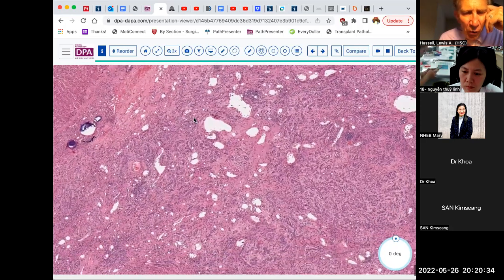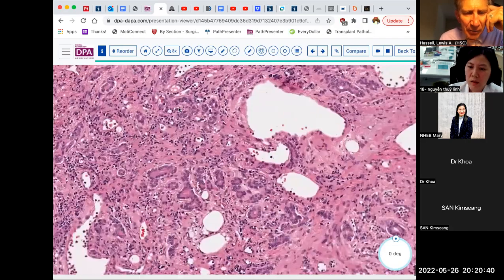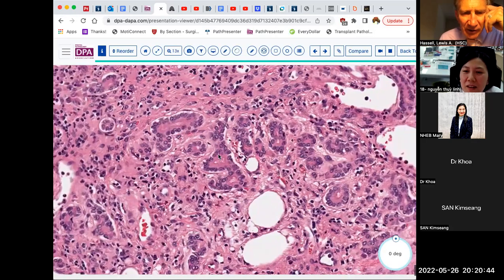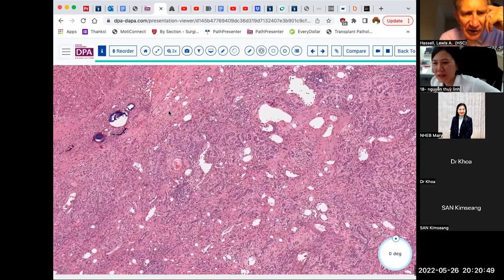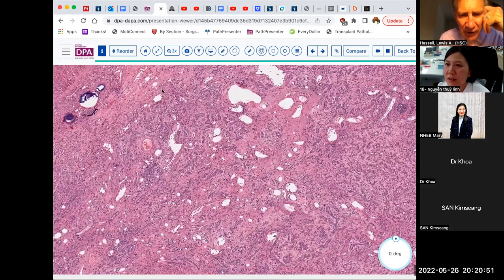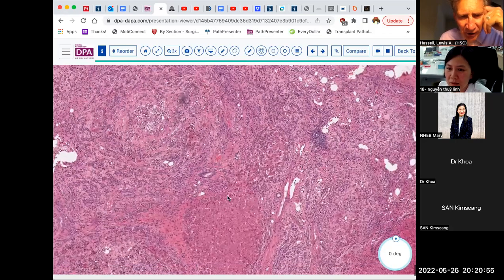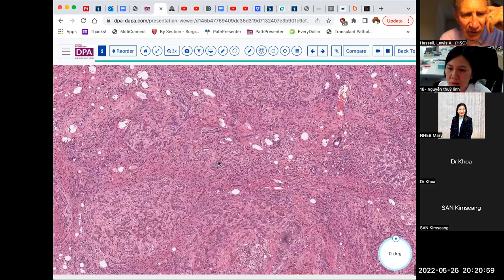And I want to show you what is not cholangiocarcinoma. So adjacent to this tumor is a very pronounced proliferation of bile duct type structures. You see there's this broad zone from here clear over to here with just bile ductular proliferation.